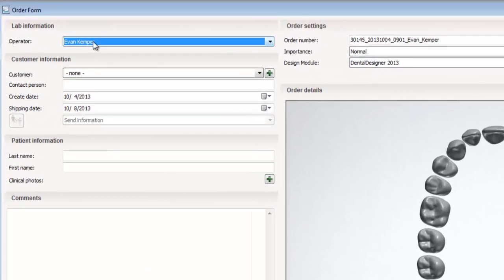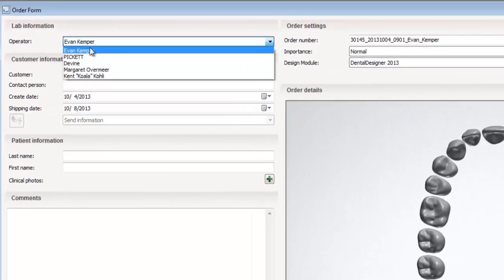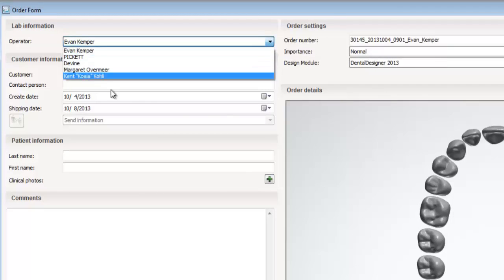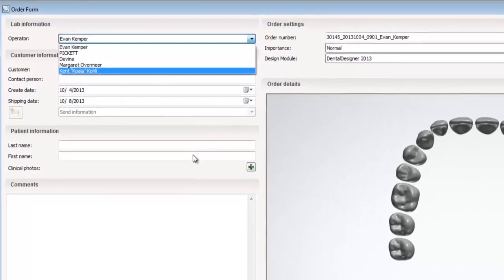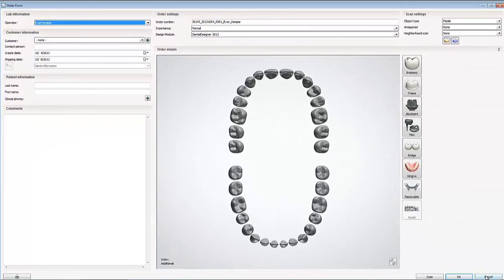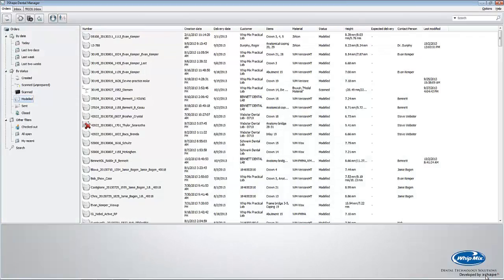The first thing 3Shape wants us to select is the operator, which in layman terms means whoever is scanning. We don't have one created for Witmix tutorials, so in order to add one, we must cancel this order. The cancel button is at the bottom right hand corner of the screen.